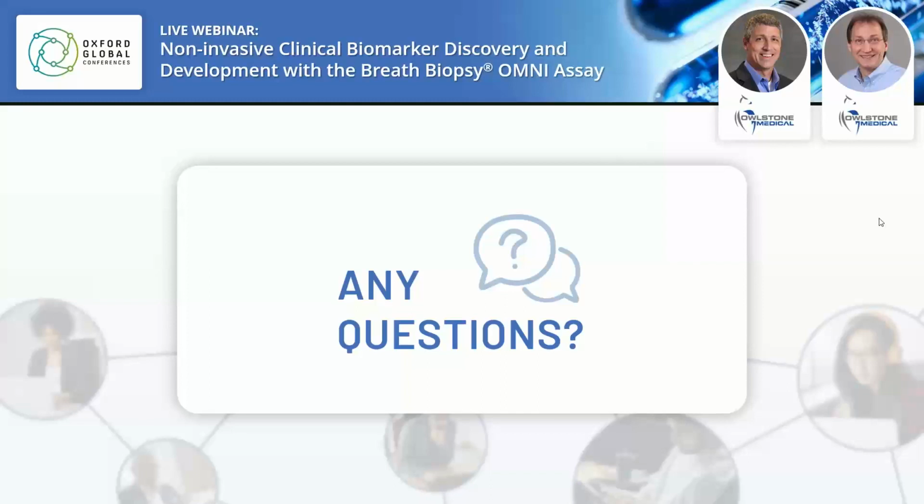Great, thank you. Next question: is the respiratory panel only directed towards airways disease, or has the panel been evaluated in fibrotic lung diseases also? The respiratory panel is really meant for any kind of inflammatory type lung disease, so you potentially could look at that as well. Keep in mind that this is essentially a panel that's been pulled together from the literature as well as some of the biomarkers from the University of Liège study. And so it's really intended to provide a readout of general inflammatory processes in respiratory disease.